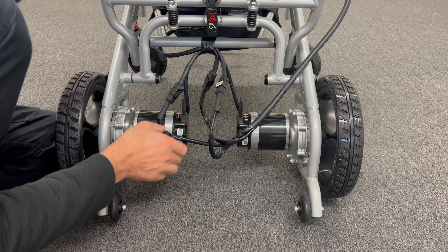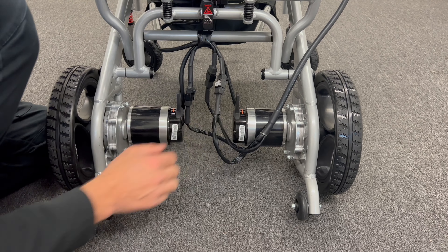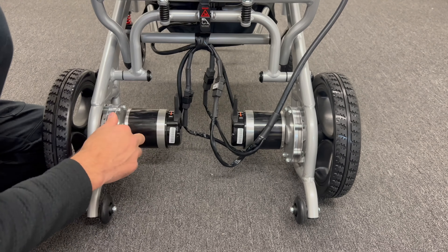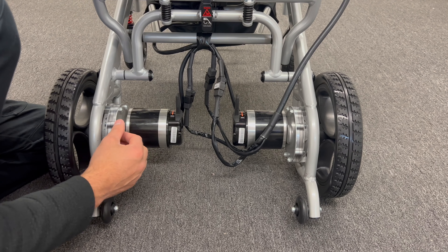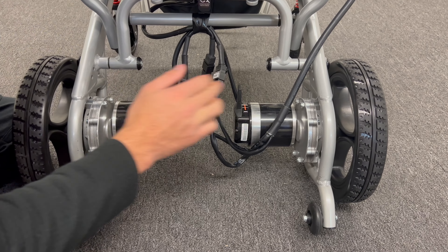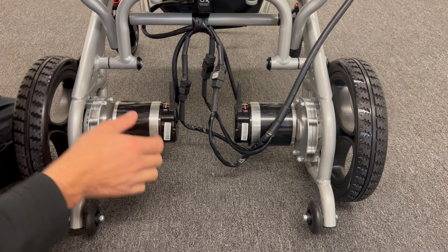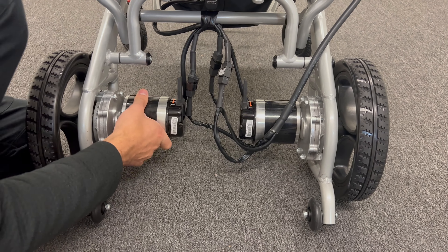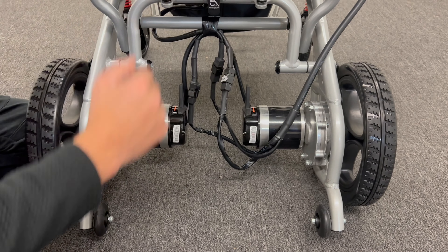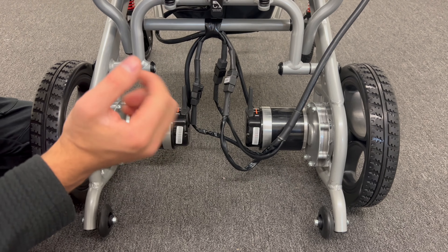If it is on the manual side — manual mode — when you push the wheelchair it will go by itself, but when you try the joystick it will not work. What you have to do is push it forward to electric/automatic mode. When you push it forward it will not go back on its own. Now you can start from the joystick and you can move front or back.